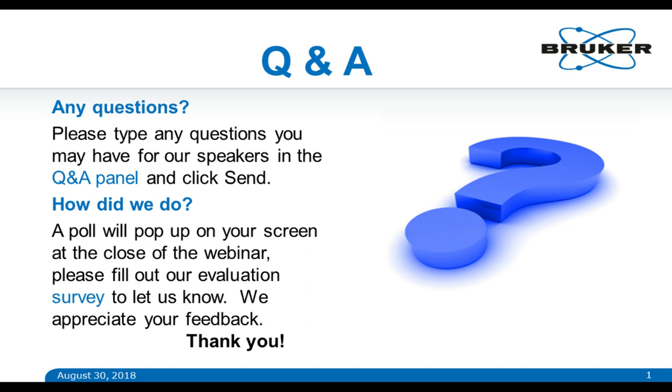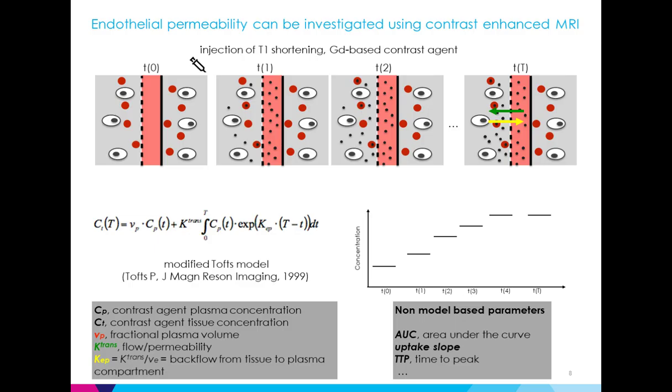Okay, so we have time for one more question. How can DCE data be analyzed? So that's a good question. So I have mentioned some approaches before during the introduction. In general, DCE data, especially in cancer where the technique has been used extensively, are analyzed using modeling-based approaches. And if I can go back to the slide that we have on the background, I think it would be easier to show you.